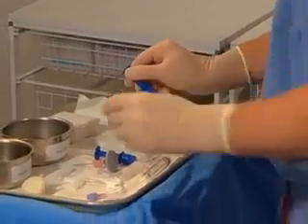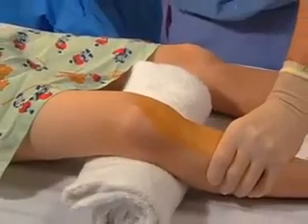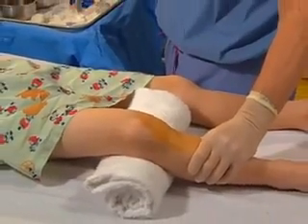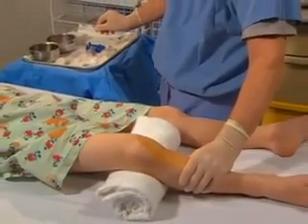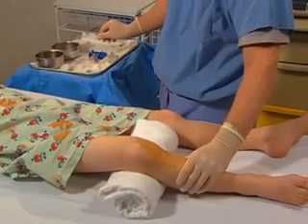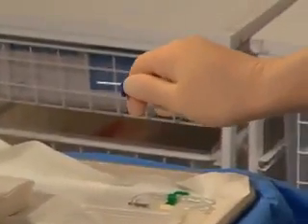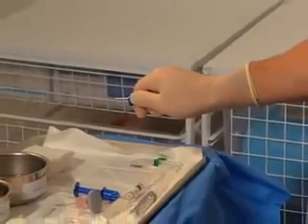Using your non-dominant hand, stabilize the limb distal to the insertion site. This allows for counterpressure against the advancing needle and prevents unexpected patient movement. Make sure that no portion of your hand is behind the insertion site to decrease the risk of needle stick injury. Place the needle handle in the palm of your dominant hand. Place your thumb and forefinger along the shaft of the needle for stabilization.